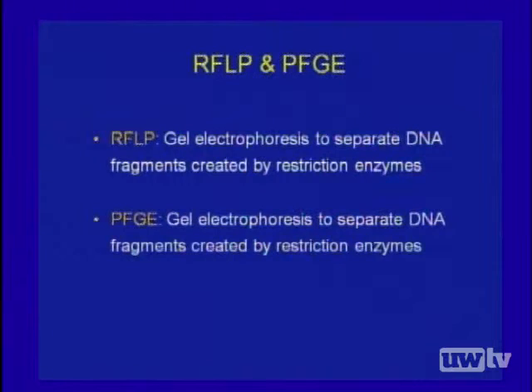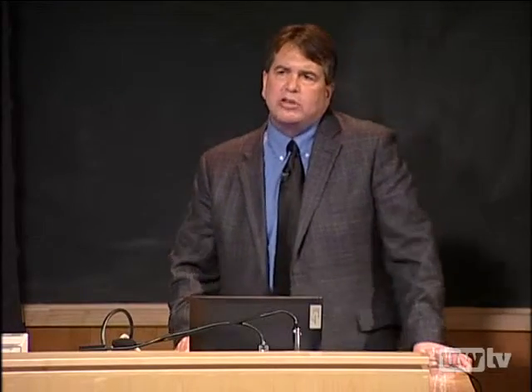Okay, first, RFLP and PFGE. RFLP is a gel electrophoresis to separate DNA fragments created by restriction enzymes. PFGE is a gel electrophoresis to separate DNA fragments created by restriction enzymes. What's wrong with that picture? In fact, they are really basically the same technique. But these are the differences.